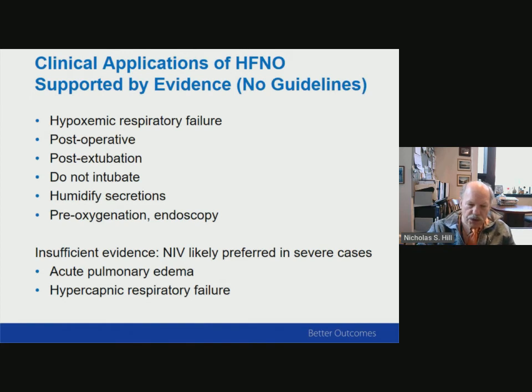There's been discussion about using high flow for acute cardiogenic pulmonary edema and hypercapnic respiratory failure. And these are the main applications, as I pointed out, for non-invasive ventilation. I would caution people about using high flow in these patients, particularly in the more severe cases. In patients with relatively mild conditions, I think high flow would be adequate. It clearly is better tolerated. So in patients who are not intolerant of non-invasive, probably not. And also use in tandem of high flow with NIV in these patients, I think would be fine.